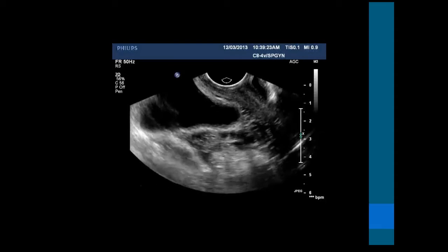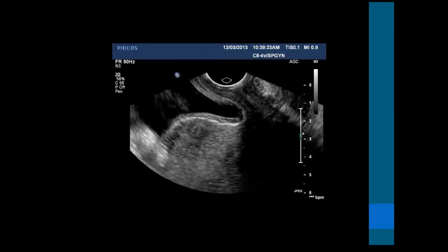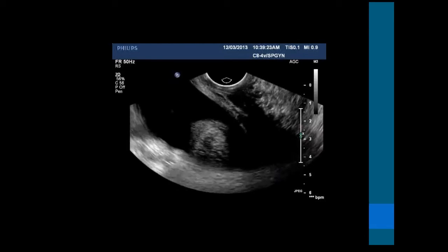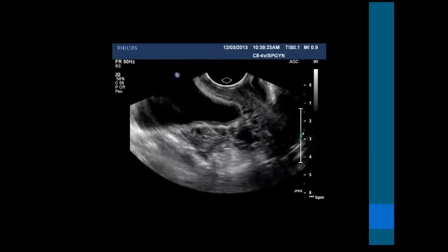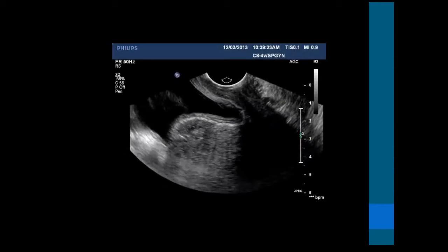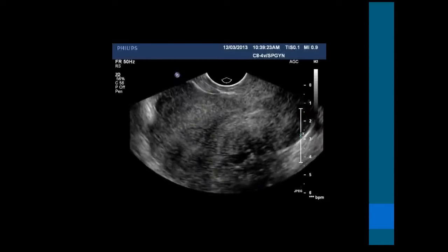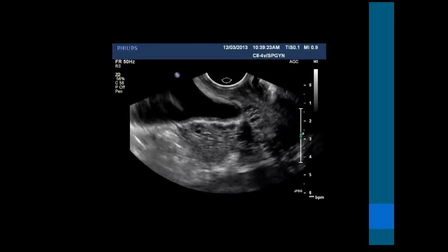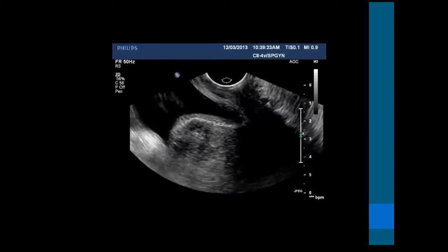The next thing I examine usually is the bladder, and the bladder is this fluid-filled structure at the front of the uterus, and I look just at the bladder wall, and this is an example of a normal regular bladder wall that is sliding. So just looking through the whole bladder from left to right, and then at the end I just push a little bit on the bladder as well to see whether the vesicouterine pouch is sliding nicely. And it will be more clear when we look at an abnormal example.